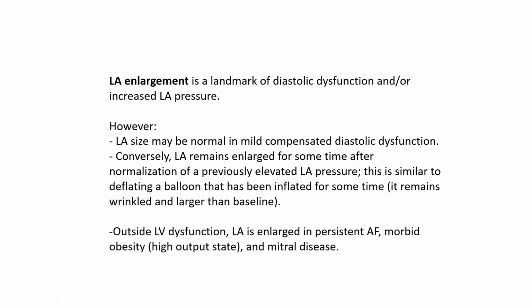It may be normal if diastolic dysfunction has been compensated for a very long time and that balloon of high LA pressure has shrunk with time, or it may be normal if diastolic dysfunction has been chronically mild and compensated with only episodic mild rises in LA pressure.